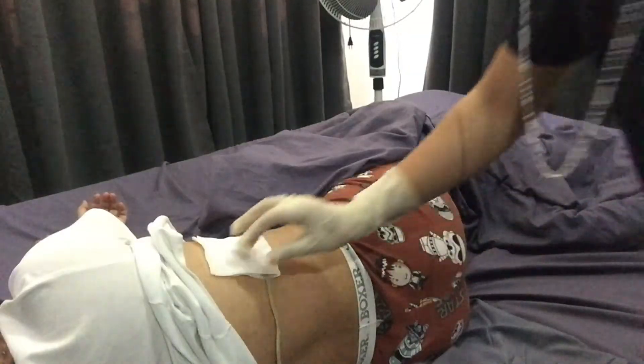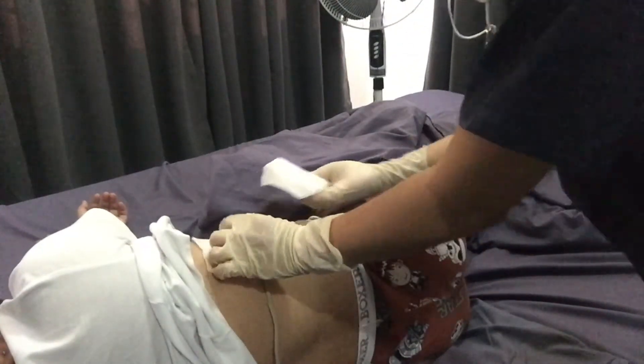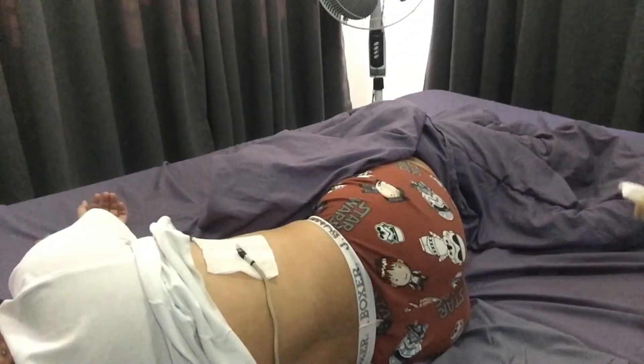After that, remove the dressing and note the color, consistency, and amount of drainage on the dressing. Observe any abnormalities on the insertion site and discard the dressing in the appropriate receptacle. Next, remove your gloves and perform hand hygiene.